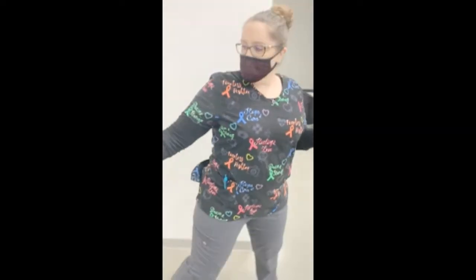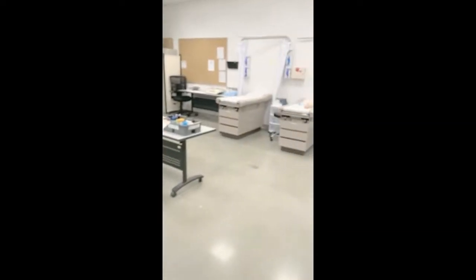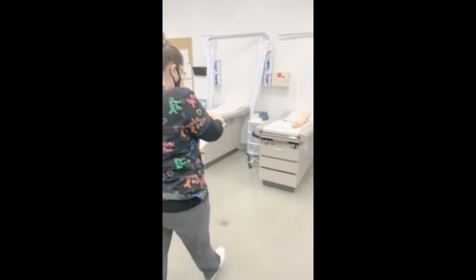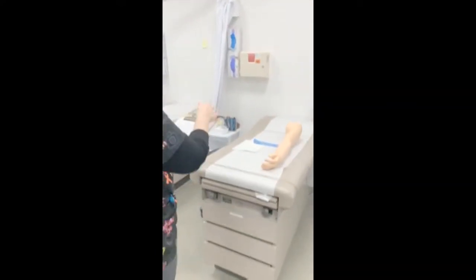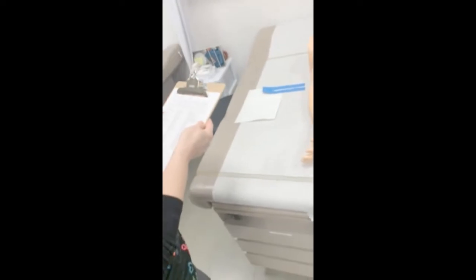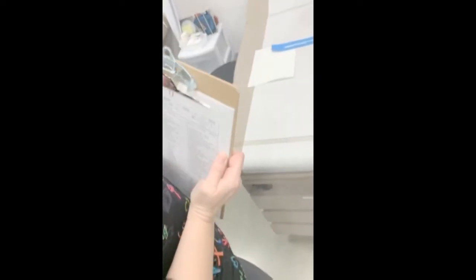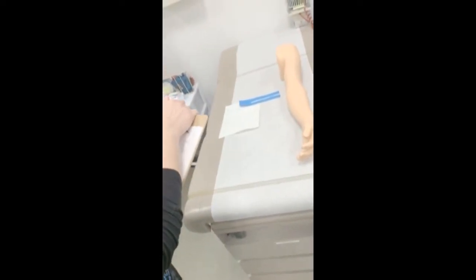Hello. My name is Mariah. I will be your phlebotomist today. Dr. Taft has ordered some labs for you. First off, I'll start off by asking you a few questions. Can you verify your name? Go ahead and tell me your first name, please.